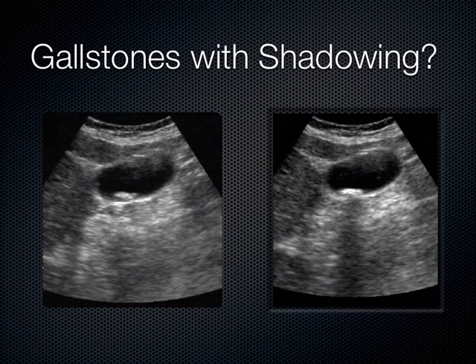So this is the same patient. We made an adjustment to the machine to get the gallstone to cast a shadow. What adjustment did we make? That's right. Some people are looking down at their iPads who've downloaded from Merlin. They see the lecture. And it's not gain. Everybody always says gain. And you'd think that we turned down the gain and we saw the shadow that way. I guess it's possible to overgain it so much that you could miss a shadow. But the answer is resolution mode.